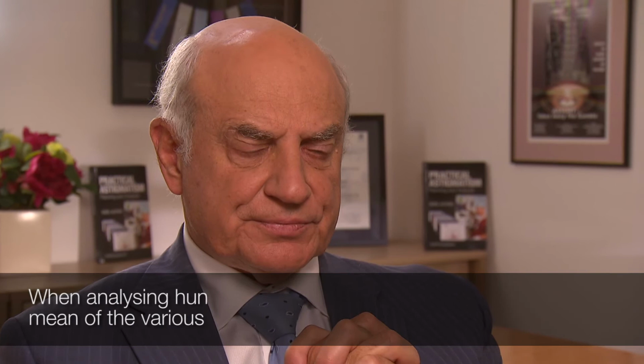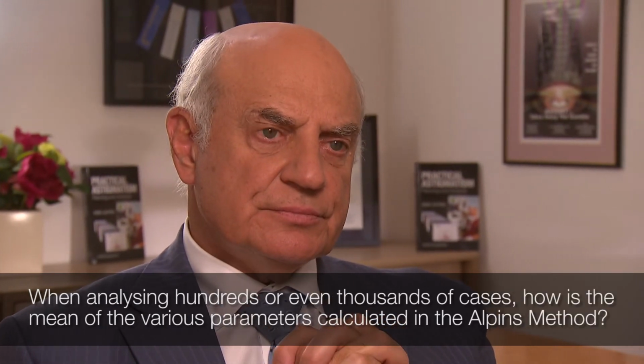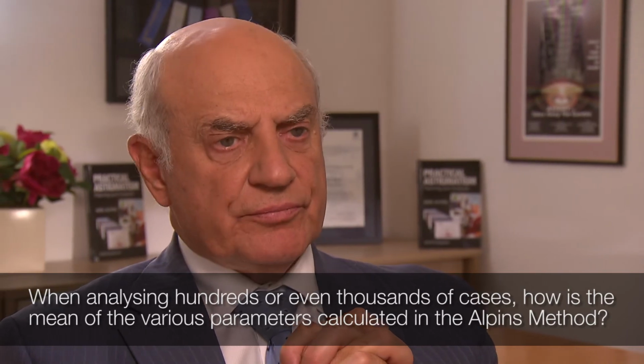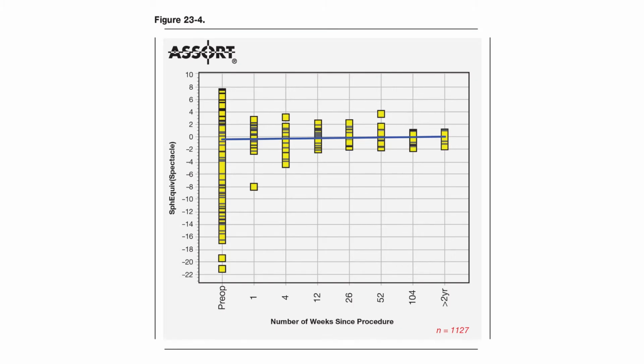When analysing hundreds or even thousands of cases, how is the mean of the various parameters calculated in the Alpins method? Yeah, so that's a good question. When you look at a lot of vectors, you can do a mean magnitude, but if you want to bring the axis into the equation, then you want to do a summated vector mean, or SVM. Some people call this the centroid.